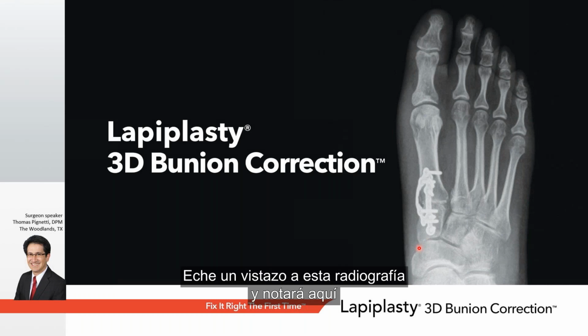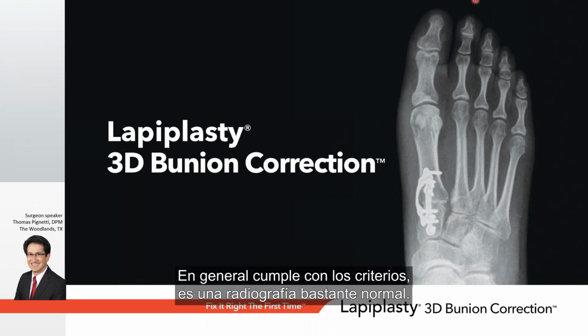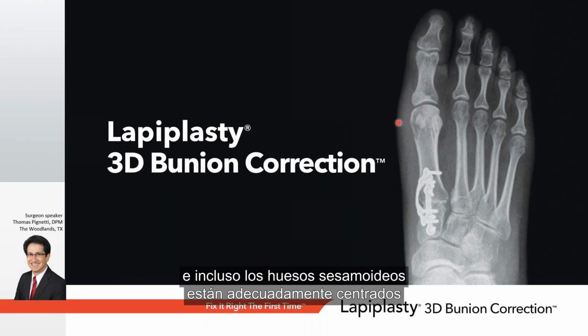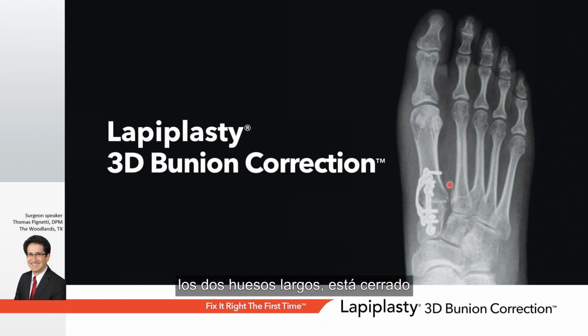Take a look at this x-ray, and you'll notice here that all the foot bones and joints look pretty normal underneath the skin, hardware down here aside. Obviously, you can tell that you weren't born with that. But overall, this meets the criteria. Pretty normal looking x-ray. All the toes are in line. The big toe lines up with the long metatarsal bone. The ball and socket relationship of the joint looks correct. And even the sesamoid bones are centered properly beneath the long bone where they're supposed to be. And then the angle between the first and second metatarsal, the 2 long bones, is closed down, and the 2 are almost parallel to one another.